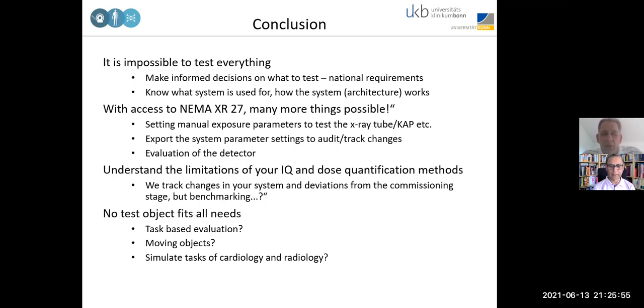Manual settings should be used for the exposure of the X-ray tube. It's not what you should do with the automatic control. Export the parameters and don't rely on something inside. So ask the vendor how you could export your values directly to audit or track your changes, and evaluate your detector very precisely and very, very carefully. And understand the limitations of your device and your quantification methods.